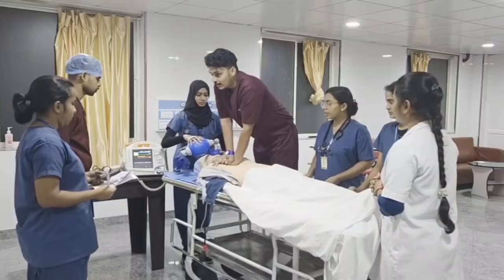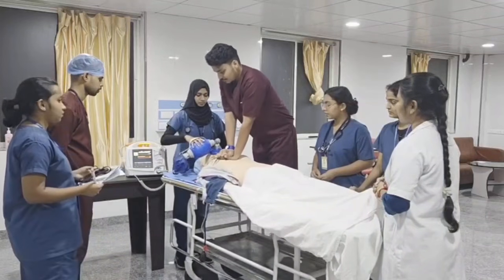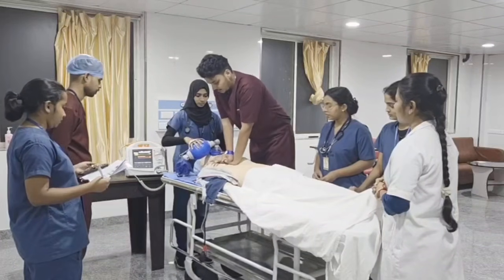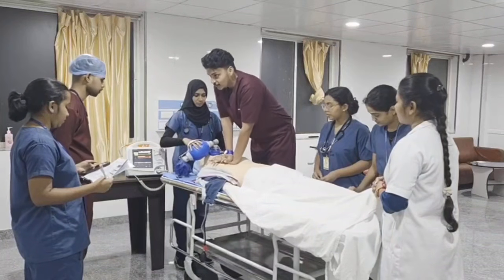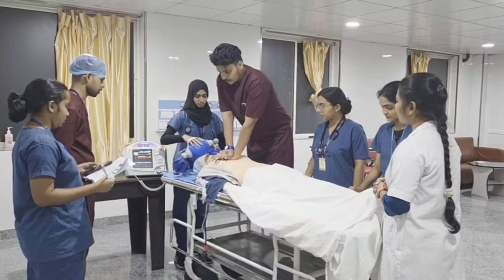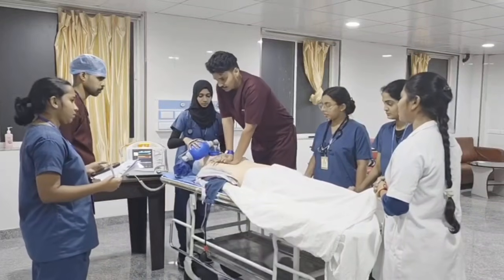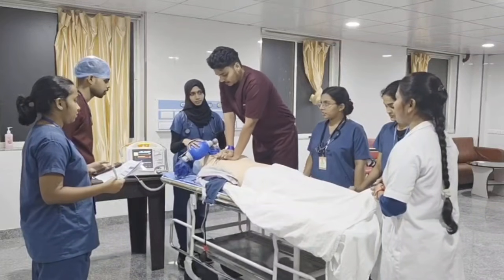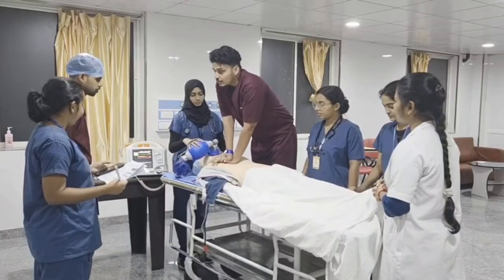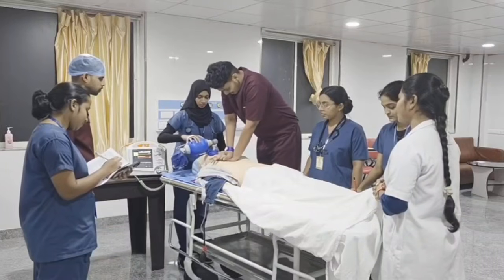Counting compressions: 6 through 30, then 1 through 7. Ensure that you are giving high quality compressions. 30, 40, 50, 60. The quality is high, continue the compression. 20, okay. 21, 22, 23, 24, 25, 26, 27, 28, 29, 30.